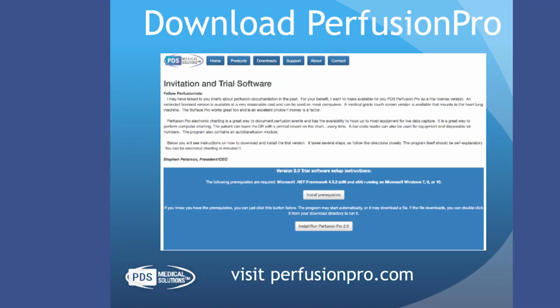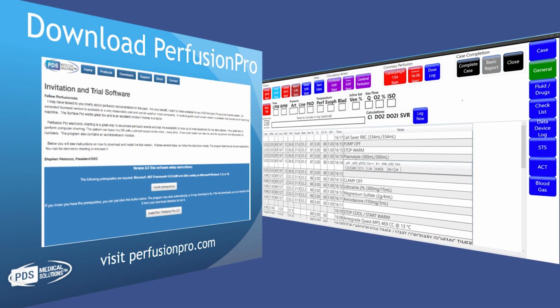I've been a perfusionist for the past 5 decades. In this time, I'd like to keep things simple. I have designed a program that is simple and easy to use, and this is something I'd like to discuss.